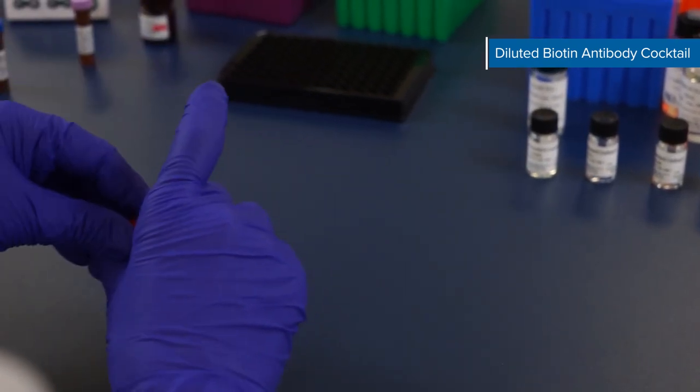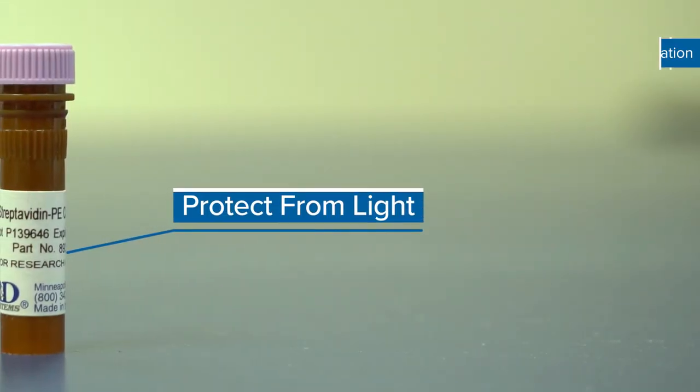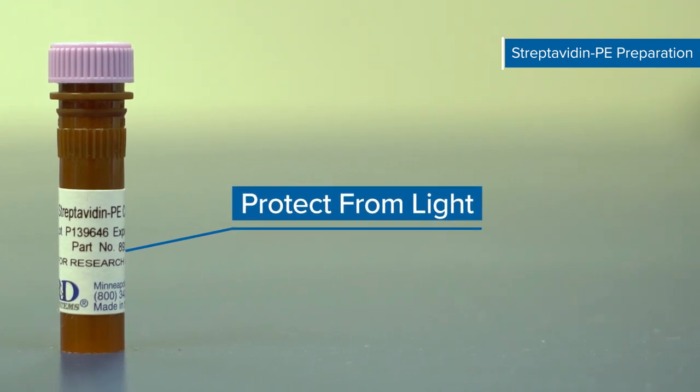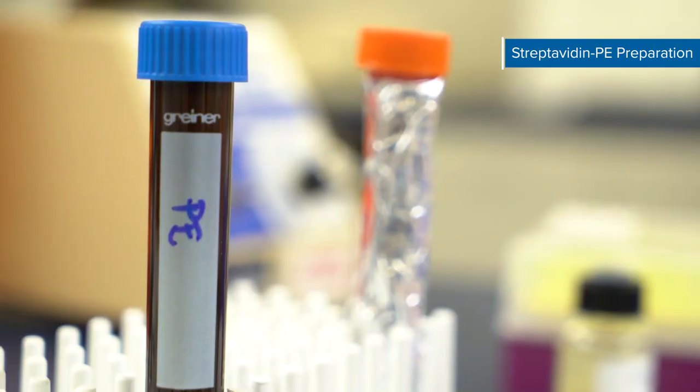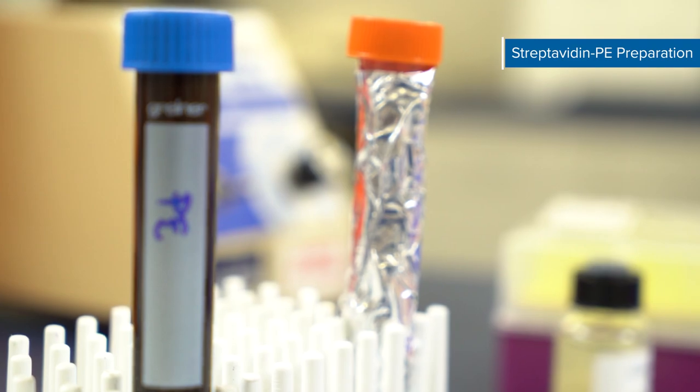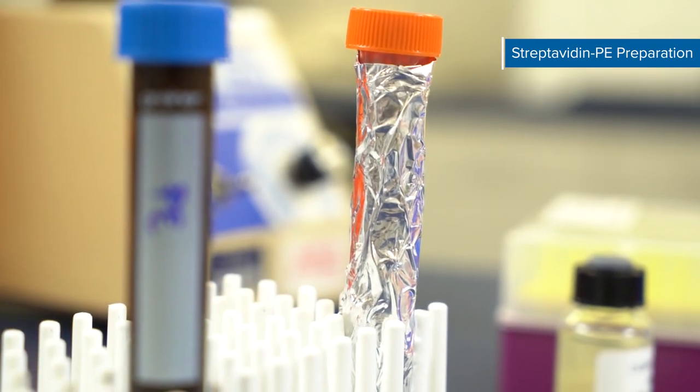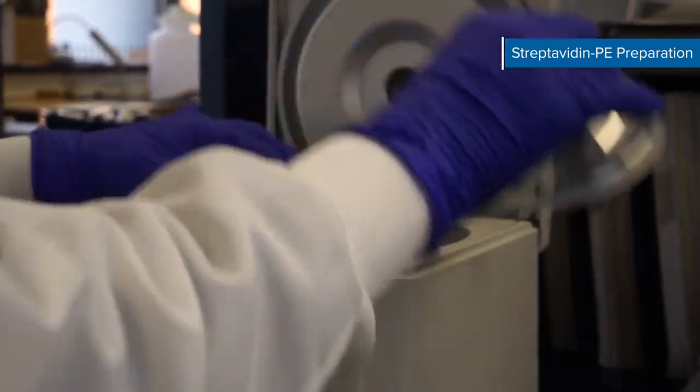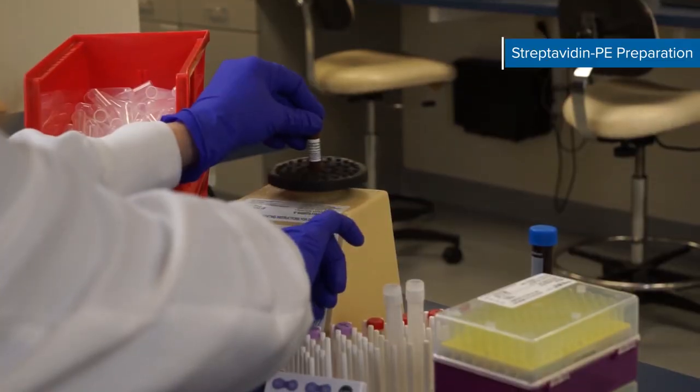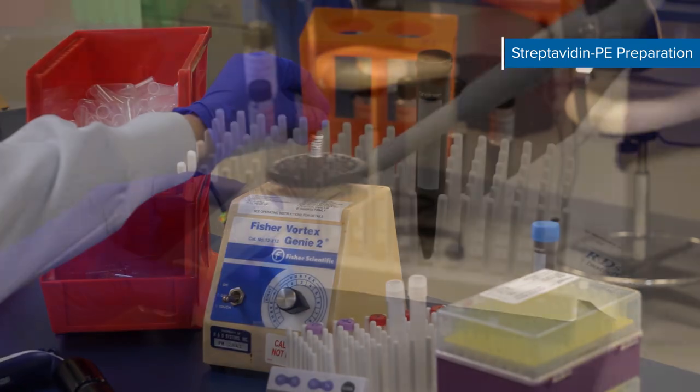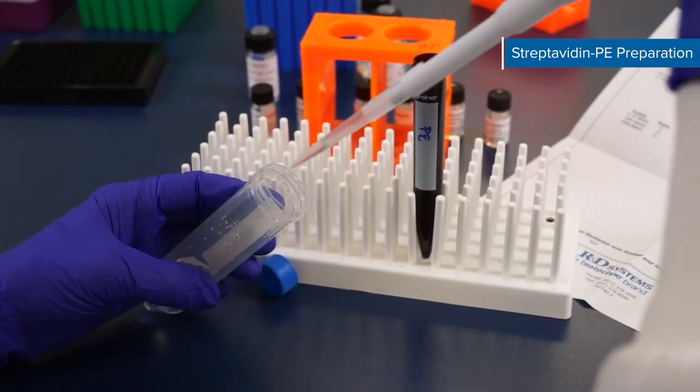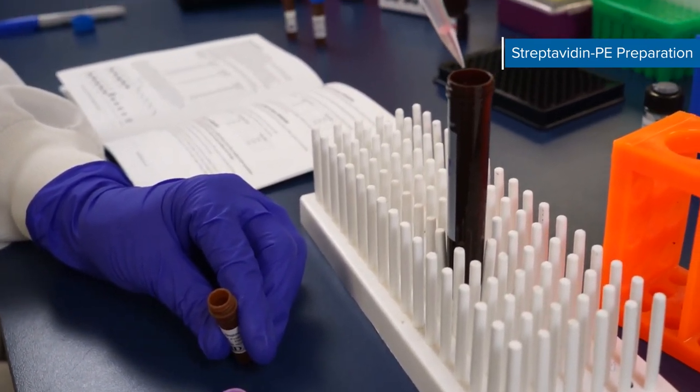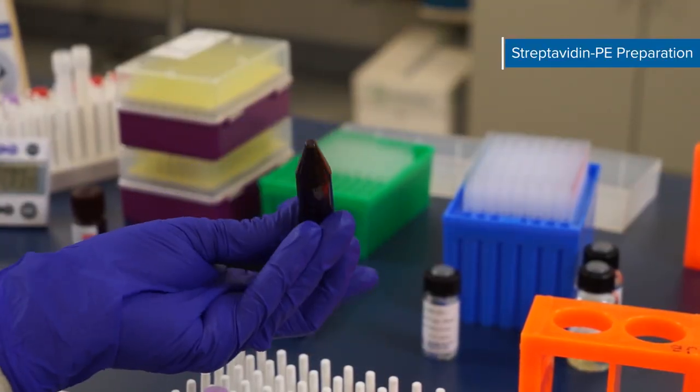Now prepare the streptavidin PE. Streptavidin PE must be protected from light during handling and storage. Use a polypropylene amber bottle or a polypropylene test tube wrapped in aluminum foil. Centrifuge the streptavidin PE vial for 30 seconds at 1,000 times the force of gravity. Then gently vortex the vial without inverting it. Dilute the streptavidin PE concentrate to a 1x concentration in wash buffer and mix gently.